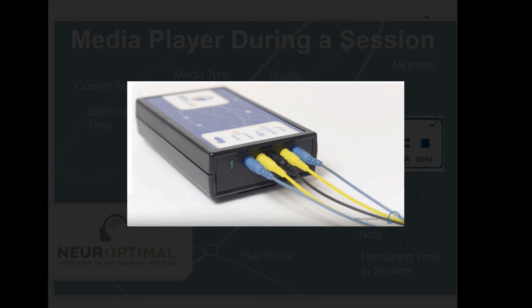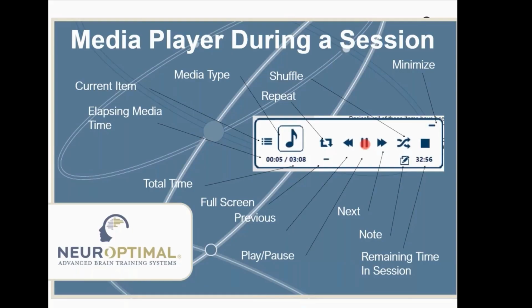On that note, normally Lisa and I won't unplug those sensors from the Z amp at all, ever. When they're new, they plug in so nice and tight that if you take them out after every session, after a while, the plastic on the end of those is going to start to wear. It's a soft plastic plugging into a harder plastic, and it's going to start to get loose and probably need to be replaced sooner than it would have. So we'll just always keep them together.